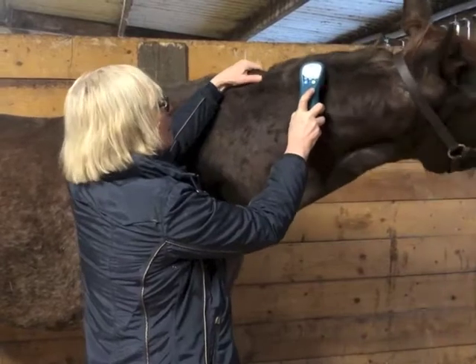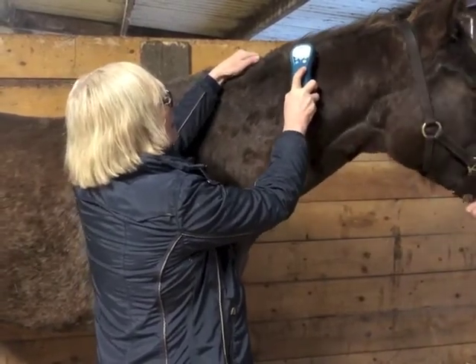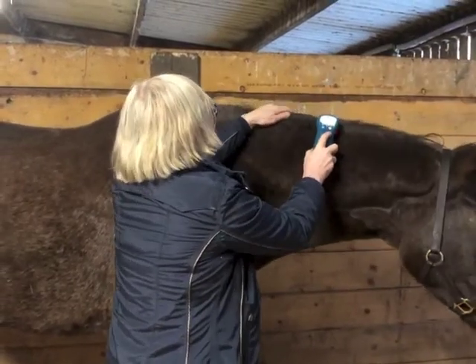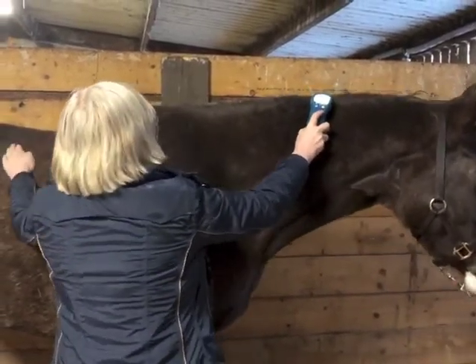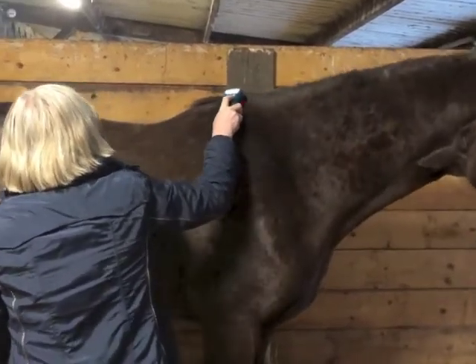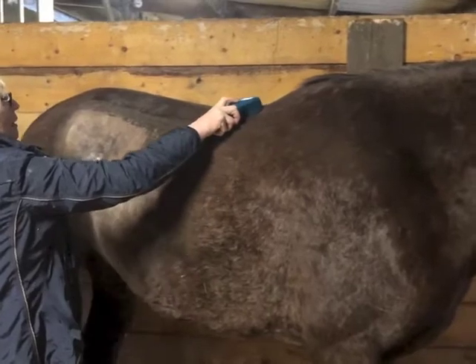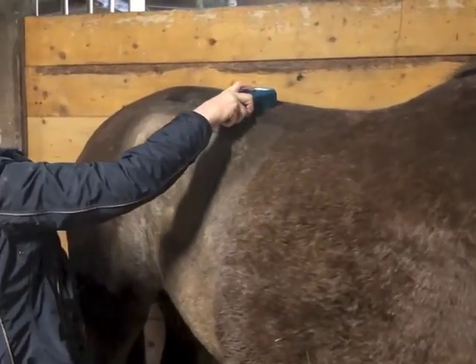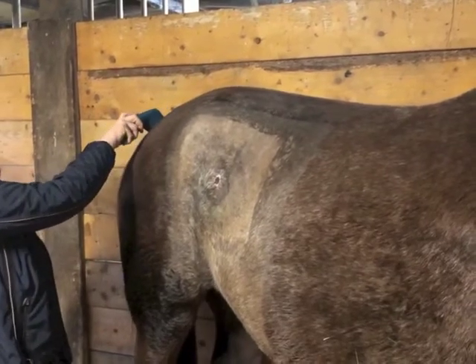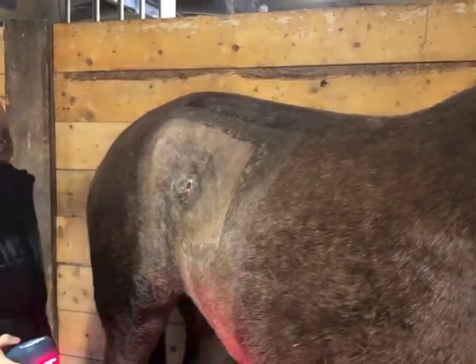Can you keep her head still? Yeah, that's cool. And maybe you could just carry on along her body just to show the line that I take. Perfect. So normally this would take 2.5 minutes all the way along here, and then I go back to the other side and I start down again. And down the other side. So that's the unwind procedure.